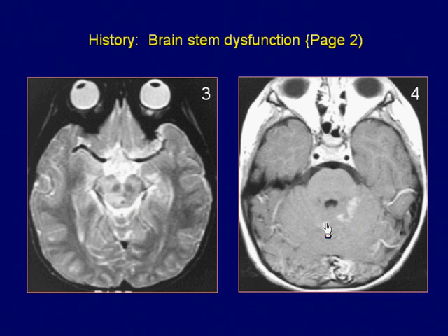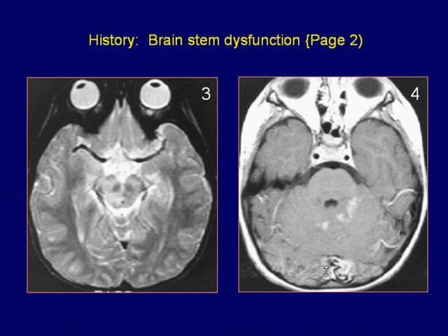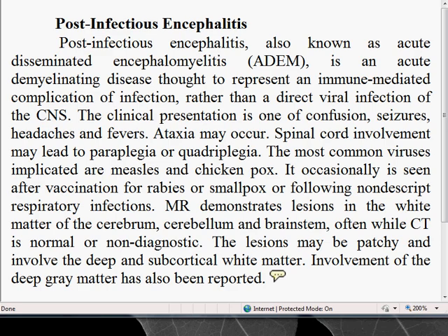Axial T1-weighted GAD at the level of the pons shows enhancing white matter lesions in the cerebellum. This is a case of post-infectious encephalitis.